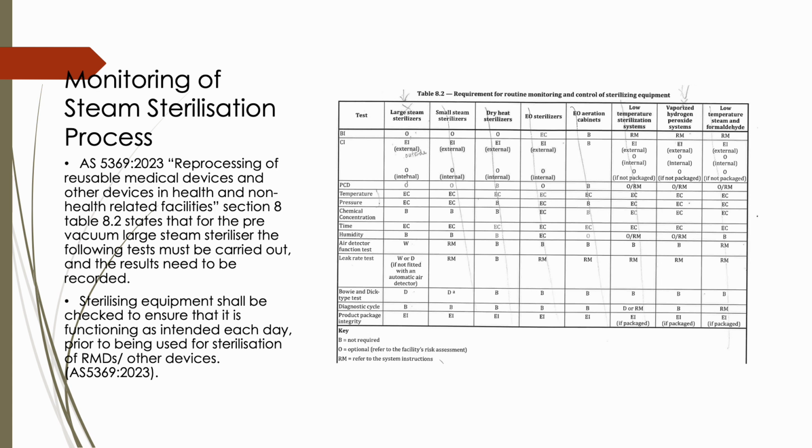Now, let's proceed to the monitoring of the steam sterilization process. According to the standards, sterilizing equipment should be checked to ensure that it is functioning as intended each day prior to the sterilization of RMDs.